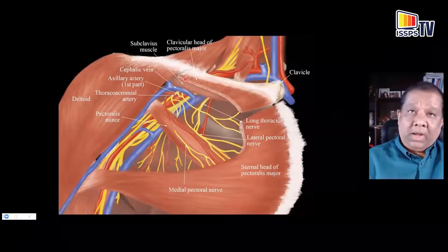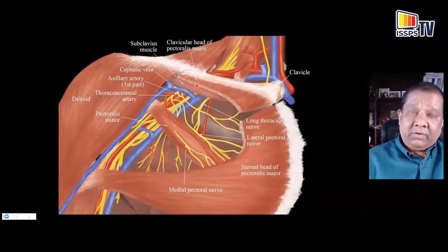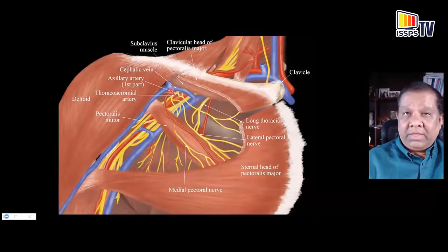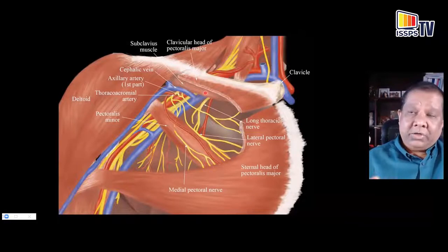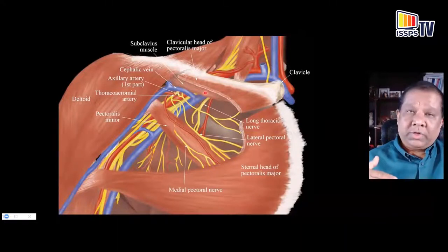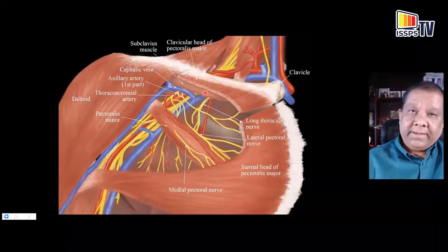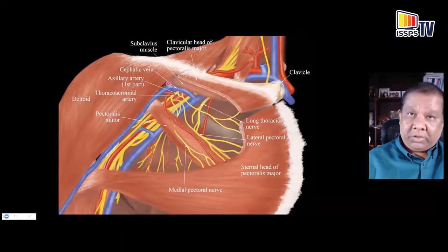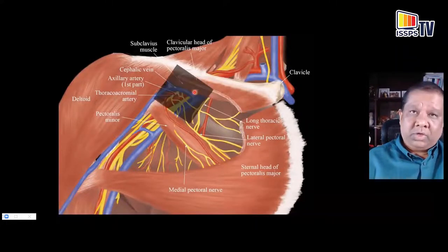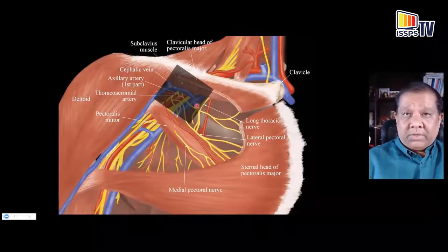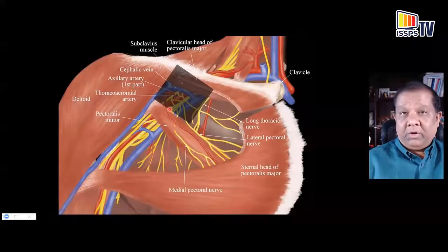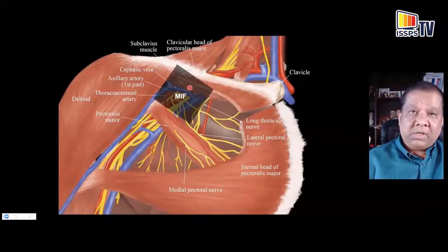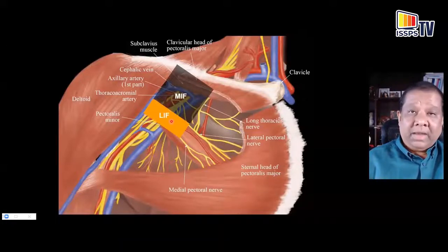While scanning the costoclavicular space, if you see the cephalic vein it is a sign that your scan is too distal — move the transducer more cephalad. Applying too much pressure may compress and inadvertently puncture the cephalic vein. For reference, the region above the upper border of the pec minor and below the lower border of the clavicle is the medial infraclavicular fossa; anything deep to the pec minor is the lateral infraclavicular fossa.